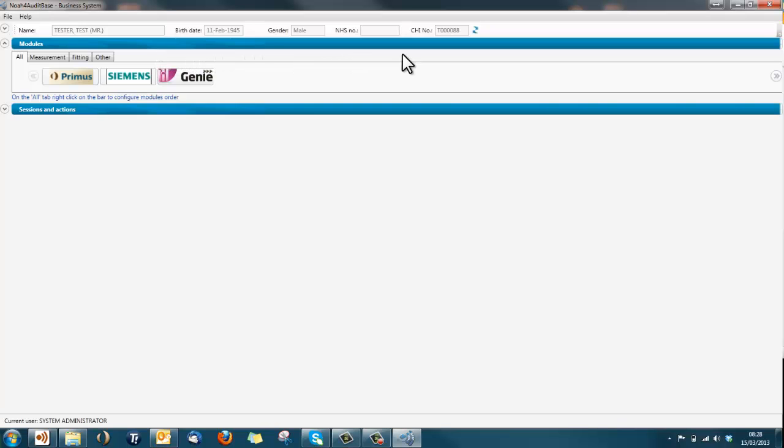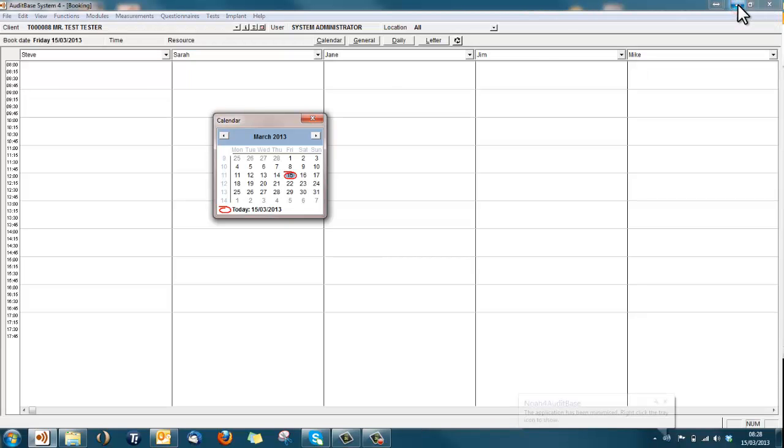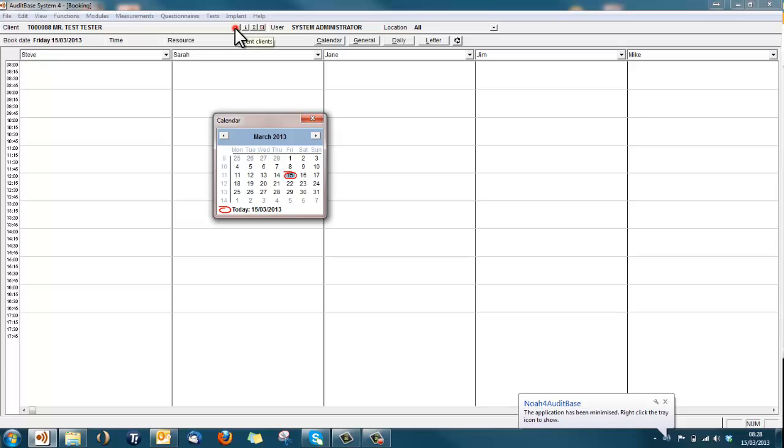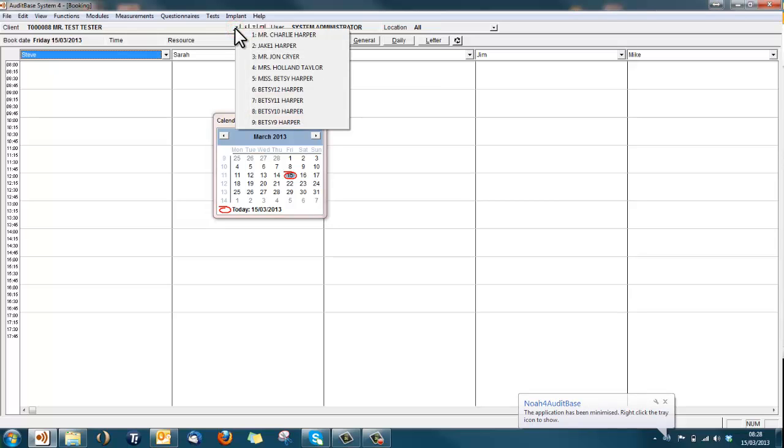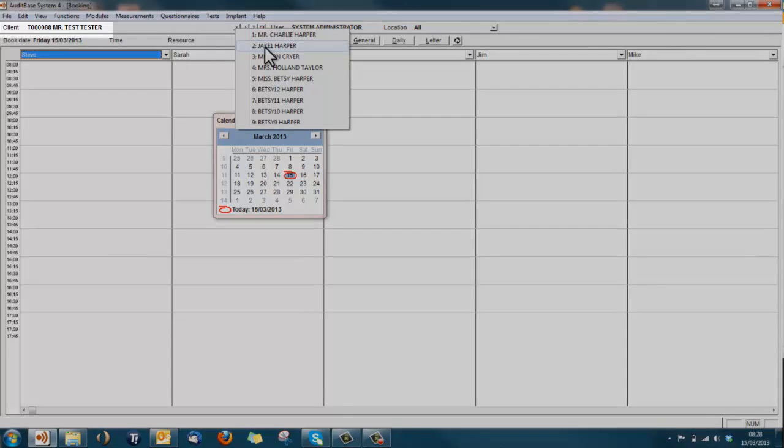A change that will hopefully be welcomed by all is that you no longer have to close down and reopen NOAA when changing client. Just leave NOAA running, re-enter audit base, select your new client, and this will automatically change the client within NOAA.